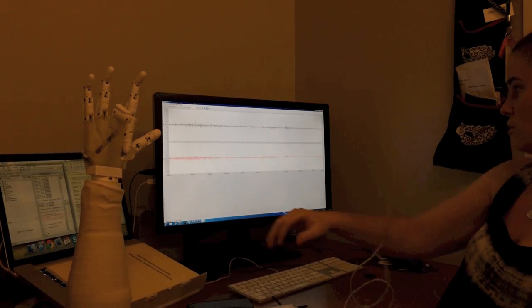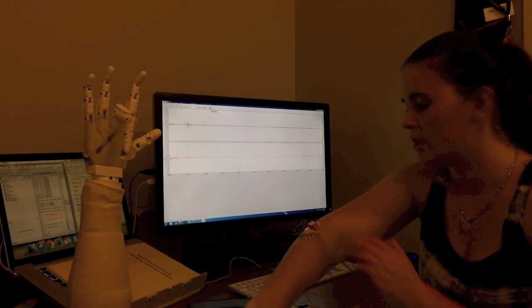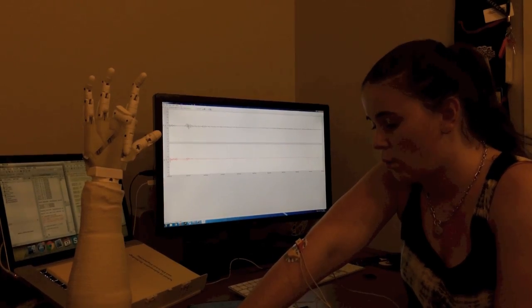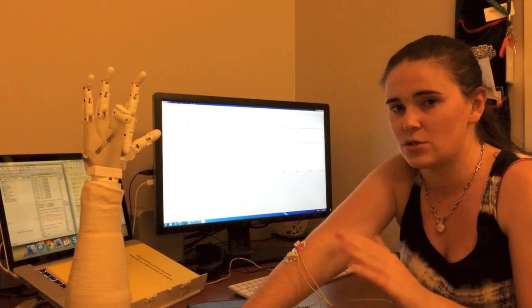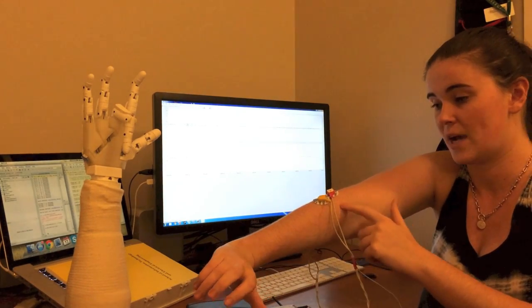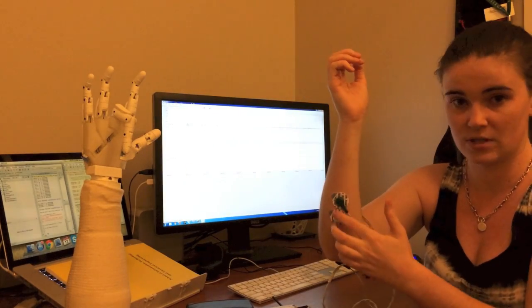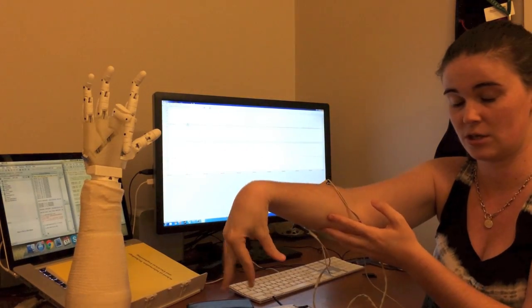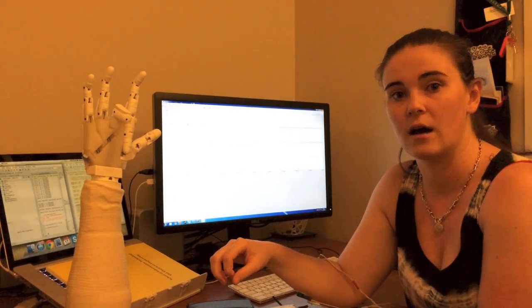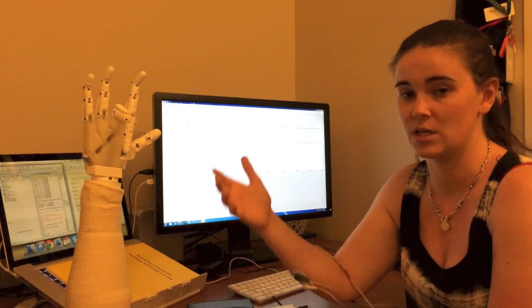So that's just looking at two of the biggest muscles in the arm, which turned out to be the best option. From that, you can see a basic truth. The top channel, which is associated with these electrodes here, activates when I do an extension motion. And the bottom channel, channel 2, when I do the flexion, and they both activate when I make a grip.